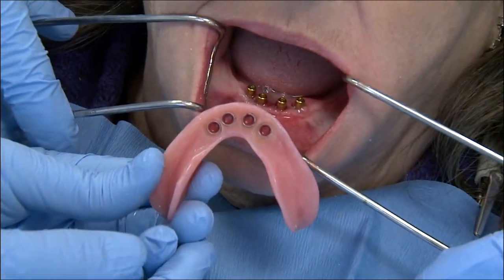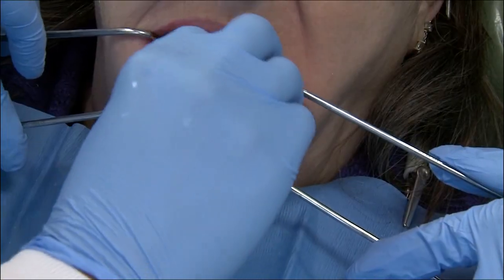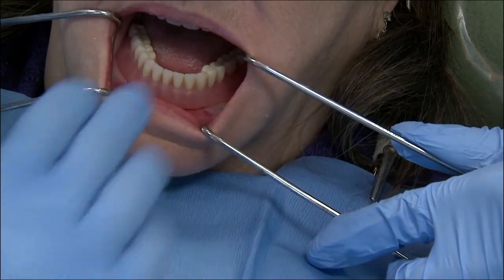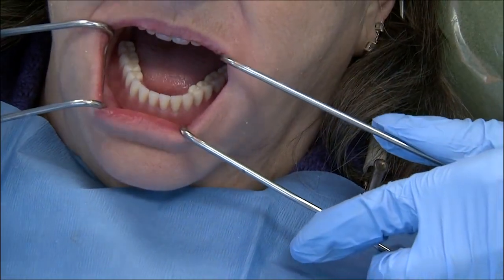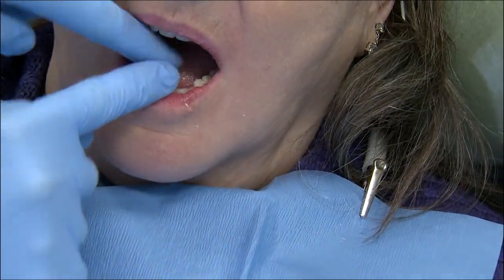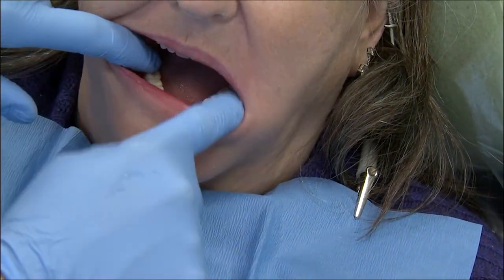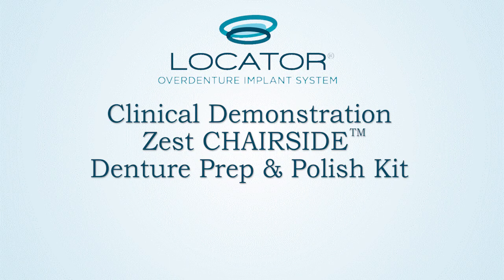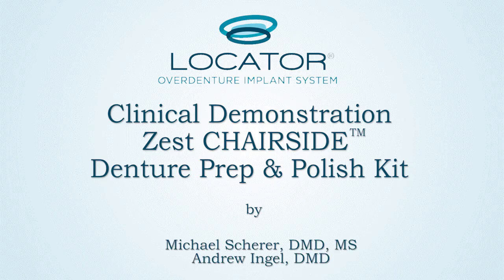Once I change over to the red inserts, I can verify that the denture has been prepared and the attachments have been properly picked up within the denture. I snap the denture into place on the edentulous ridge, verifying that I hear that nice audible click and have excellent stability. I check with the patient to make sure she feels good and the bite feels right. This is Dr. Michael Shearer, and this has been a clinical demonstration of the new Zest Chairside Denture Prep and Polish Kit. For further information or to find out how to order it, go to ZestAnkers.com. Thank you very much. Stay tuned for further videos in the future.